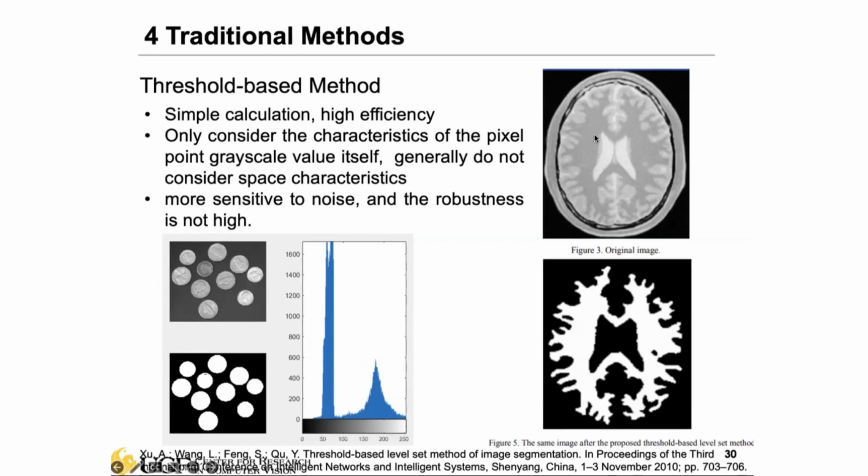There's a darker region, pure black, then you have maybe 2 or 3 different shades of gray: this may be a little bit bright, and then this is darker, and even darker. So you can plot the pixel intensity like this, and maybe set up 2 or 3 thresholds so that you are able to differentiate these different groups of pixels.